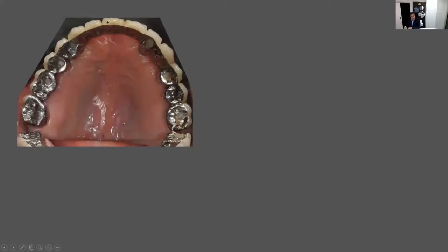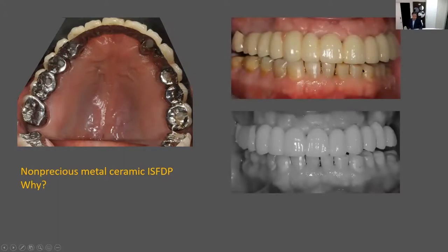But having said that, that's the occlusal prescription I have for this patient, because it's a non-precious cast, and it allows me to improve the longevity of the restoration, okay? Let's have a look at the lower one, and you can see that excursive movements are all basically around the implants. That gives me more support and reduces the stress on the implants. It allows me to redistribute forces of occlusion, and that's important.